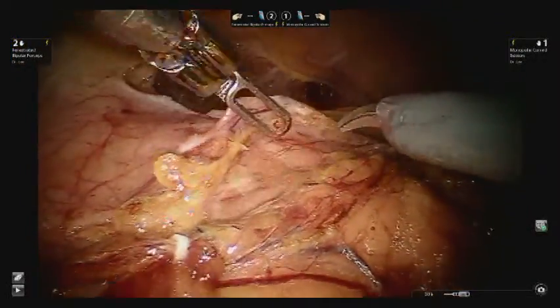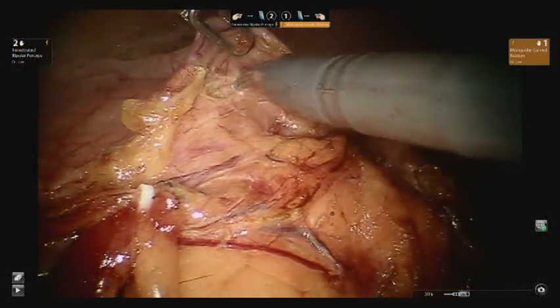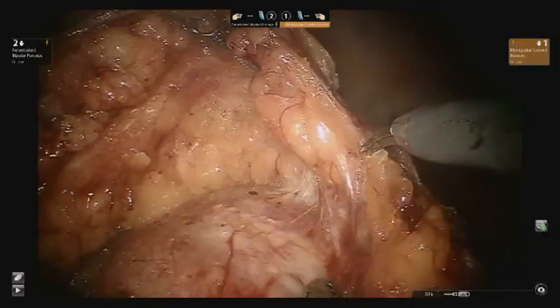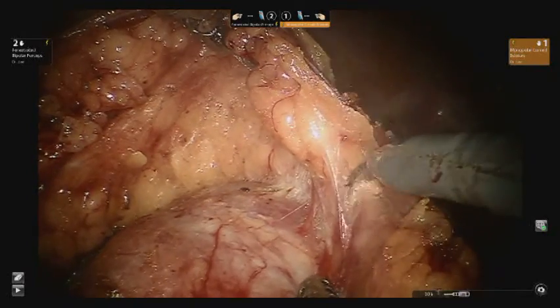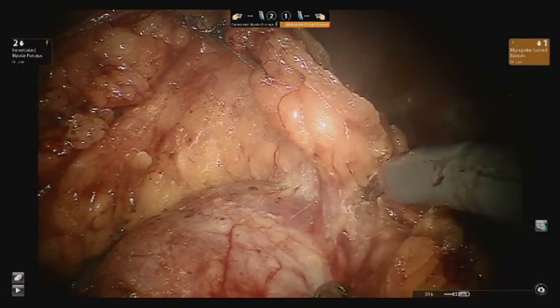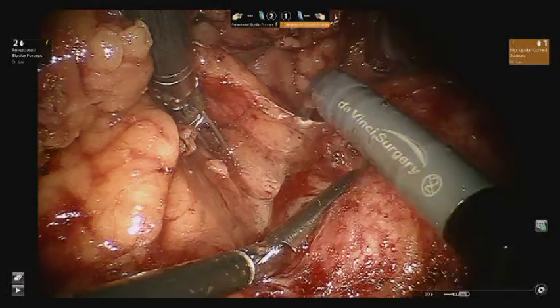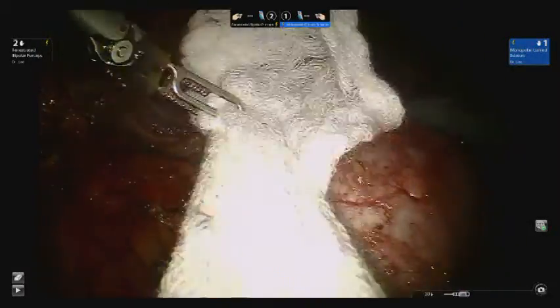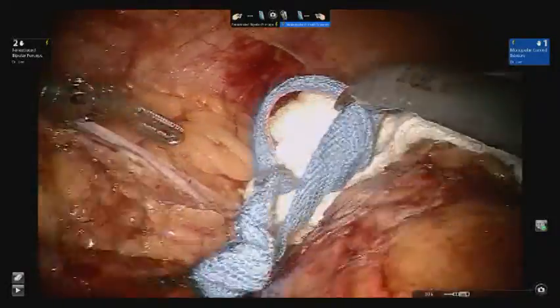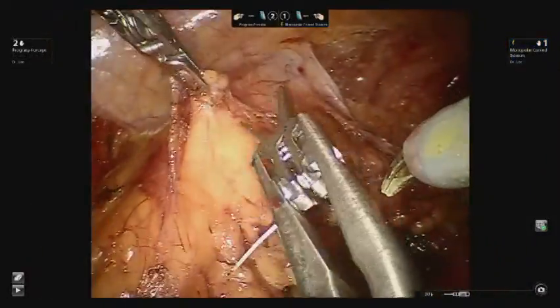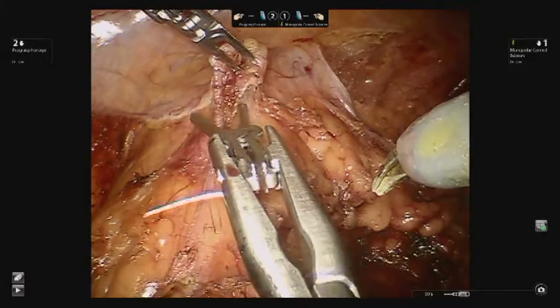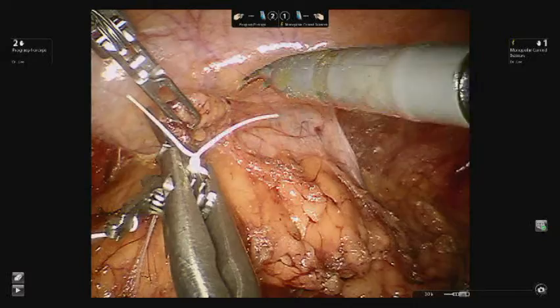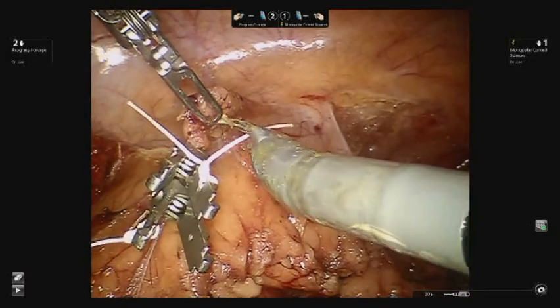Release of Gerota's fascia is then performed to expose the renal mass and allow for complete mobilization of the kidney. A mini-lap is placed posterior to the upper pole to help maintain position, retraction, and exposure of the posterior mass. In preparation, the robotic bulldog clamps are placed in the abdomen on the perinephric fat for easy access and to minimize reliance on the bedside assistant.